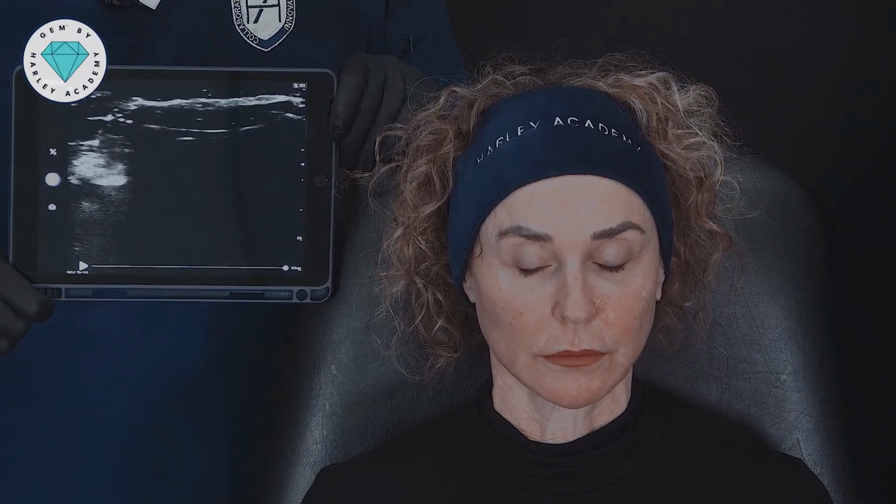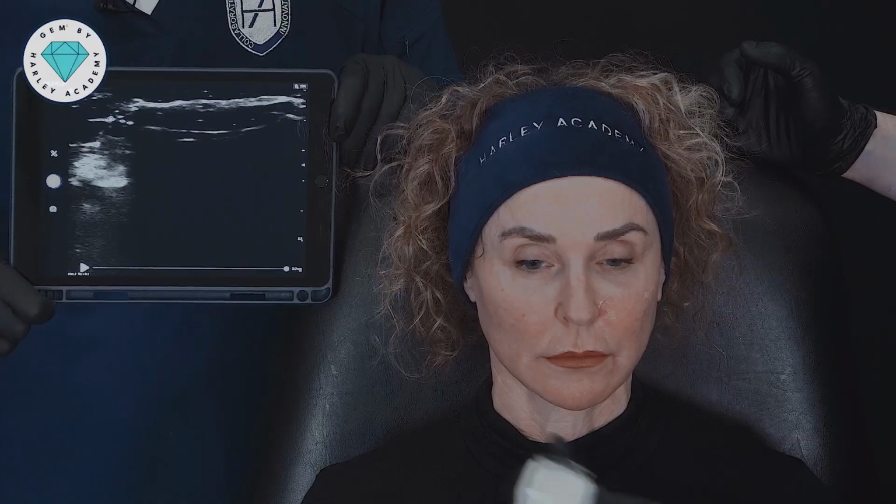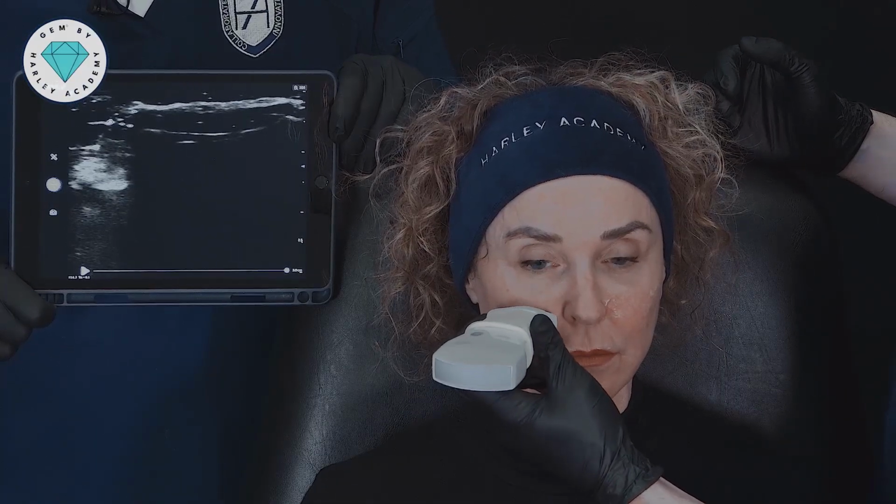So what do you think, Max? Would we dissolve this by treating with a cannula or with a needle? I think cannula in, again, between, so popping underneath the SMAS, but still staying in that pre-maxillary space. Sounds good. So let's have a look on this side as well.